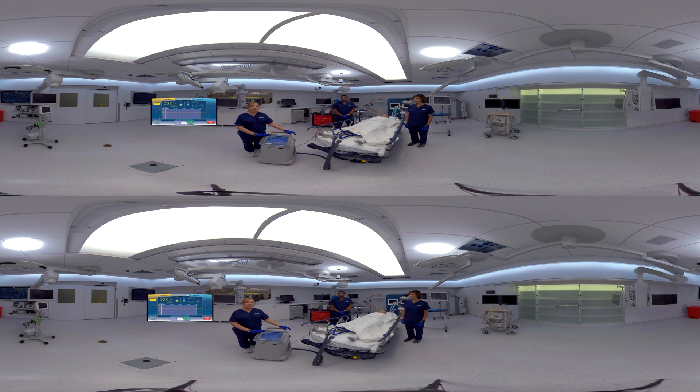When you're looking at the screen, everything in yellow is information about your patient and everything in blue is information about the water. This yellow number is your patient temperature; the blue number is your water temperature. Over time, you will see the graph start to populate with lines. The dotted yellow line is the target temperature as programmed into your device. The solid yellow line is your actual patient temperature. And the solid blue line is your actual water temperature.